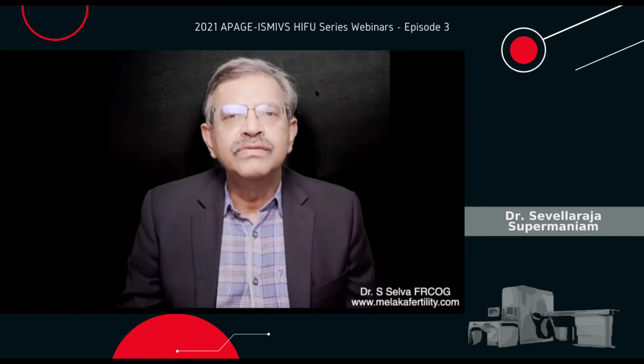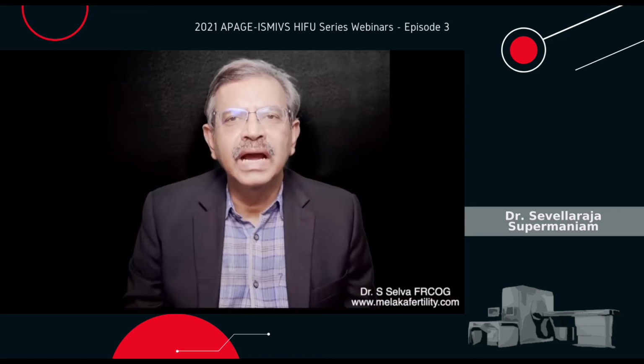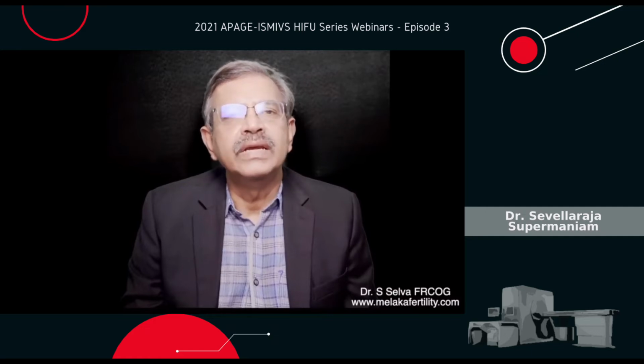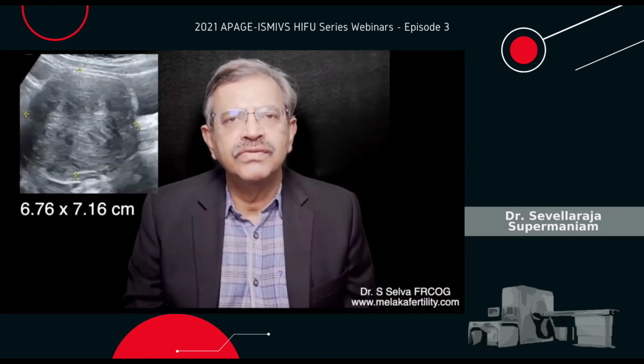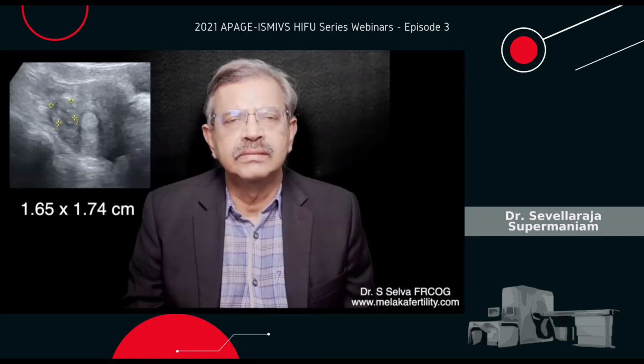In this video, I will describe how HIFU is performed for fibroids and how we assess whether the HIFU surgery is successful. My patient is a 32-year-old lady with a 7 by 6 centimeter fibroid. This fibroid causes pressure symptoms for her. Ultrasound showed a large fibroid measuring 6.76 times 7.16 centimeter. There was another smaller fundal fibroid measuring 1.65 times 1.74 centimeters.